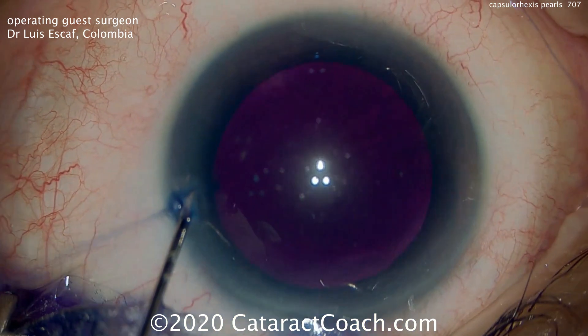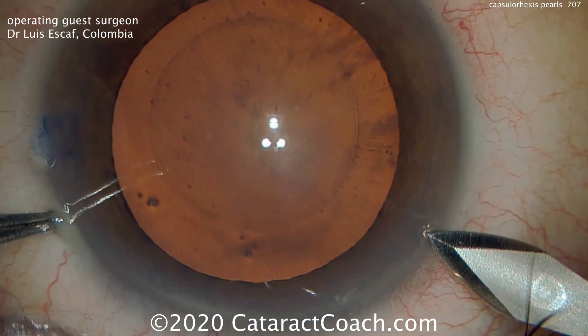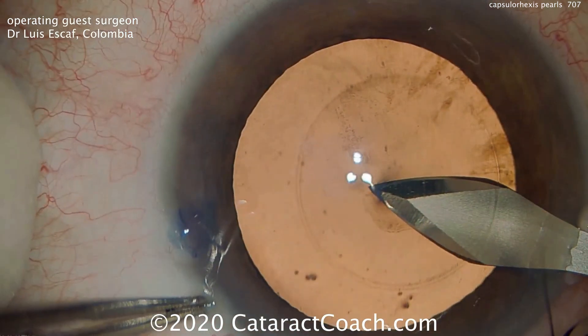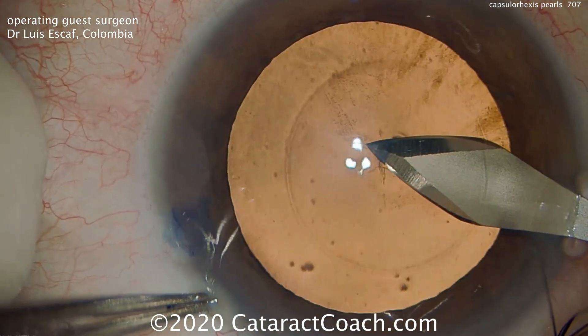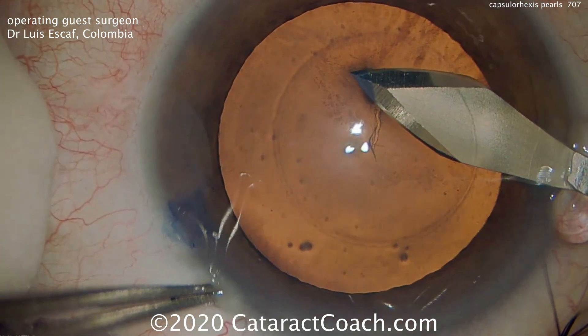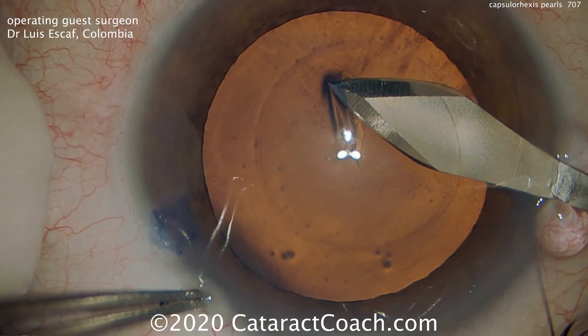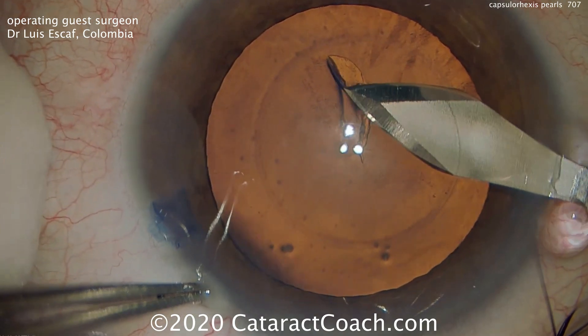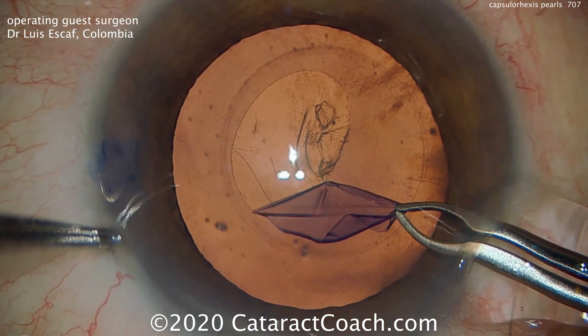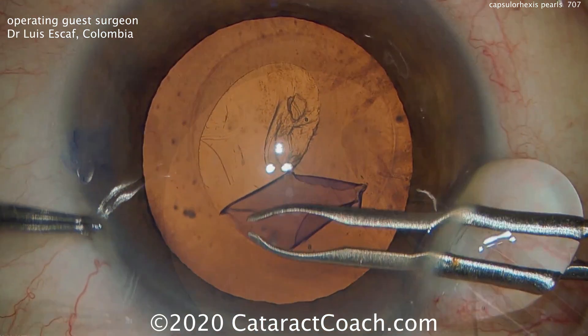We'll make a 5.5mm mark on the cornea, and that corresponds to a 5mm rexis. The main incision is being made, and now the same keratome is going to be used to slice into the anterior lens capsule and flip over the capsule to start the capsulorhexis. Very interesting technique — I've never seen this before. You could use a cystitome instead, but this technique saves a step.